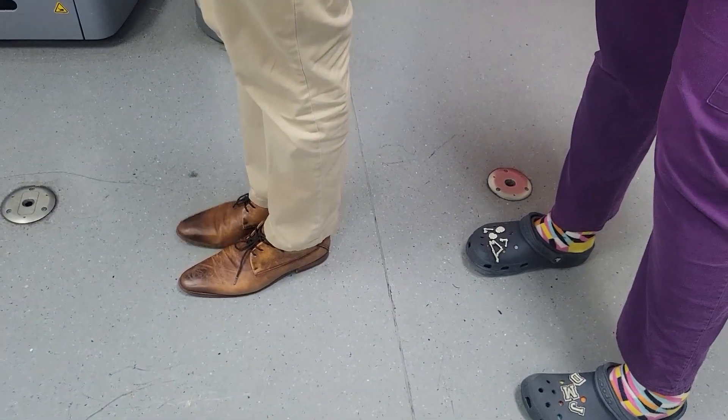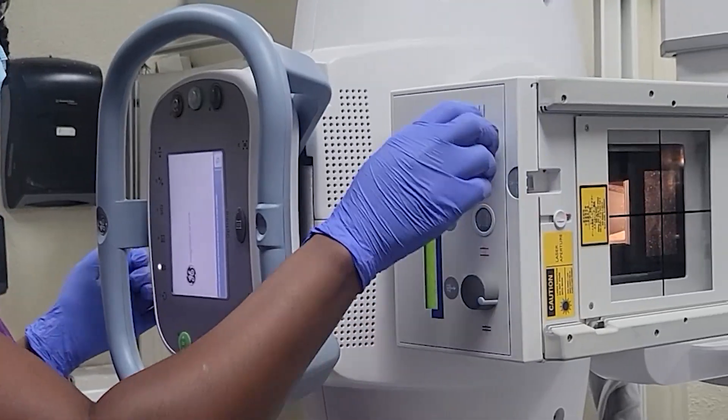The next thing I tell patients is to step closer to the bucky — actually take a step, don't lean. A lot of patients will lean in toward the bucky rather than stepping, and leaning causes rotation or an off-tilt. You want to minimize magnification by getting them closer, and you also want a true representation of what's going on. If one side is further from the image receptor it will be magnified, so have them take an actual step into the bucky.